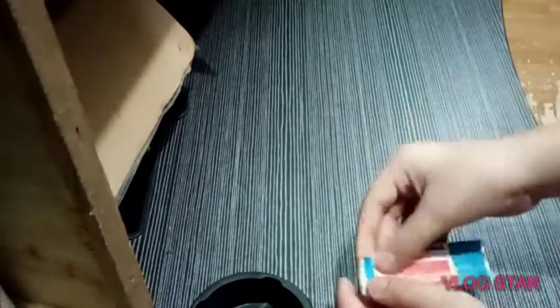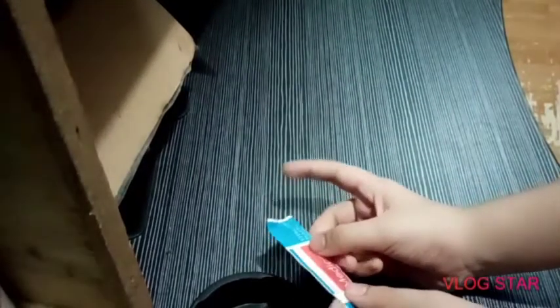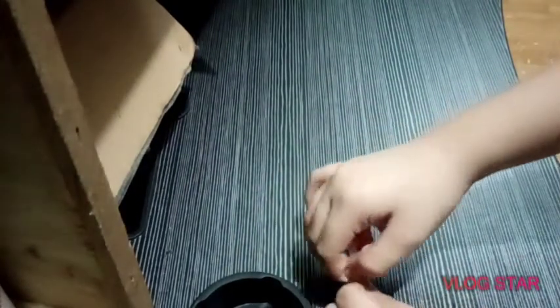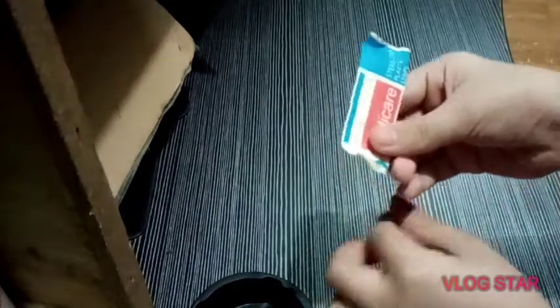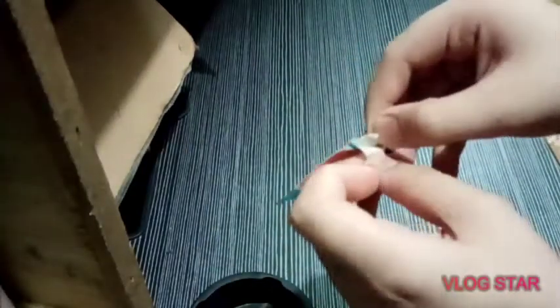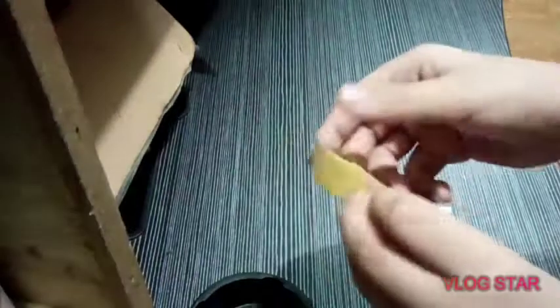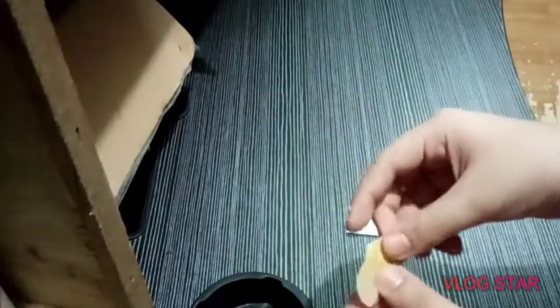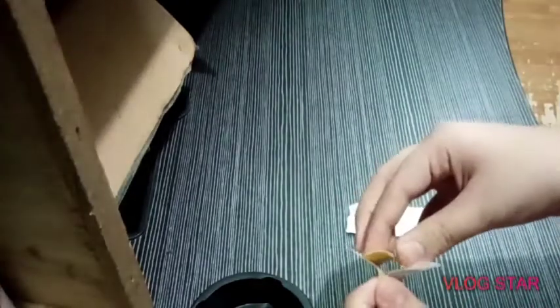So to open it, this is my style of opening a band-aid. I usually rip the pack over here, and then the piece of the band-aid will just come out. Here's the piece of the band-aid, or bandage.